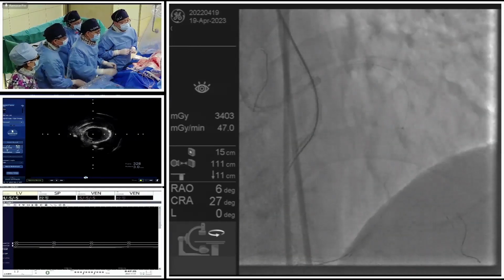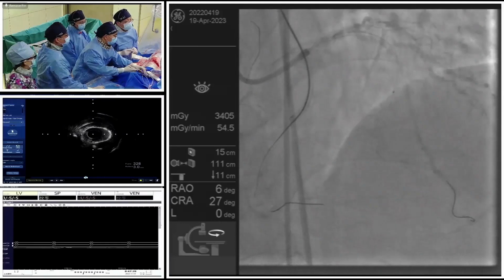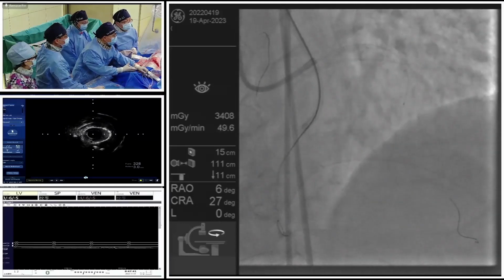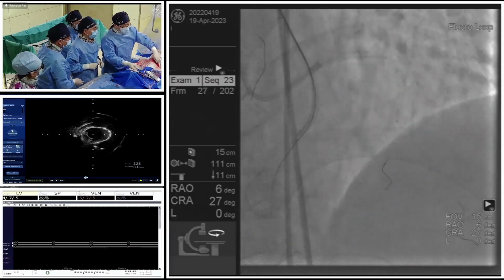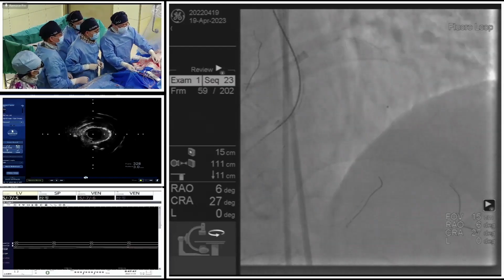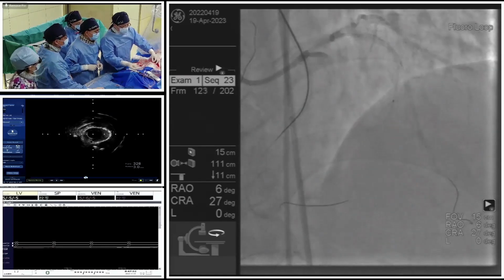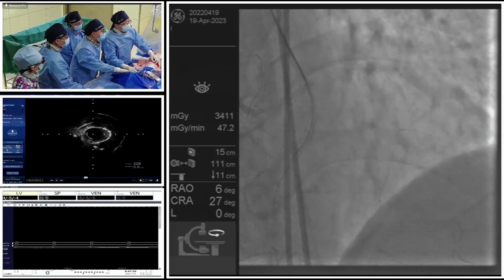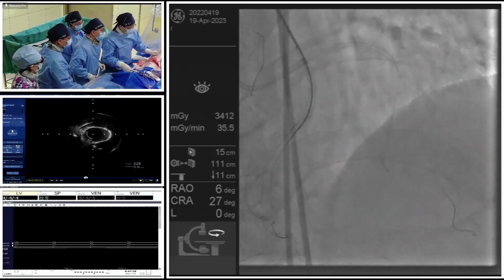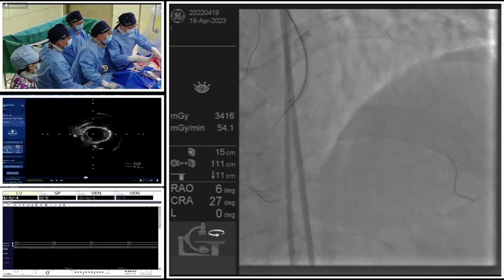Okay, we see that Professor Li has just brought the wire across the septal collateral so fast. So we'd better advance the retrograde Sion wire a little bit further to give more backup support, and see if the Fine Cross could cross freely. Okay, a little bit of resistance. It is a little bit anterograde guiding.